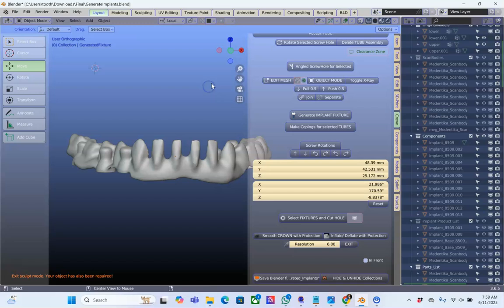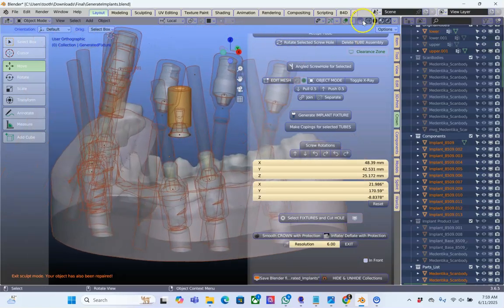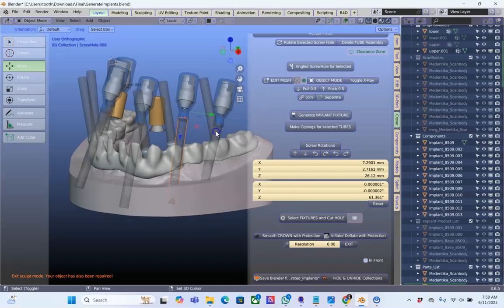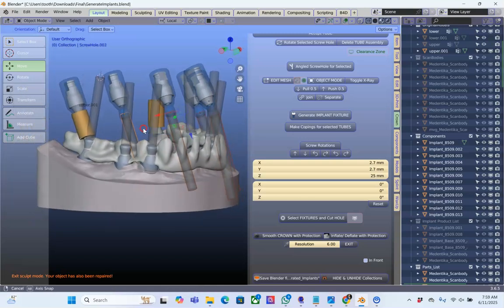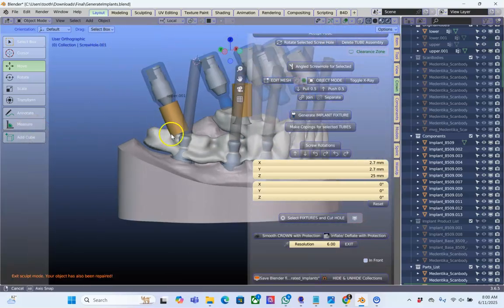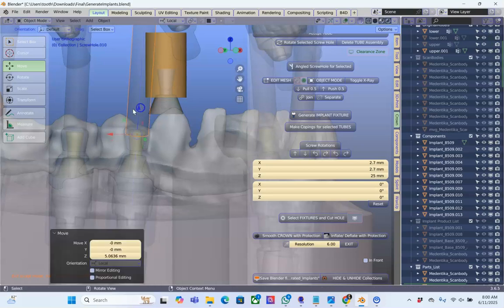So lastly, make your holes. Okay, again, I don't want it to interfere with the uppers, so I'm just going to hide, make sure you hide them, otherwise it could puncture a hole from the uppers. You don't want that to happen. H to hide. Look in a transparent mode. Just bring these up a little bit.